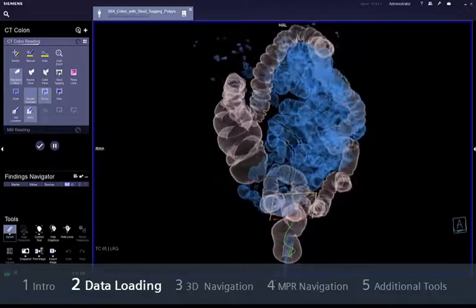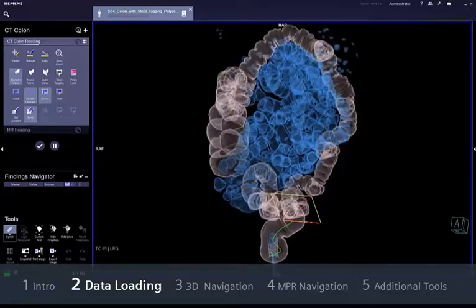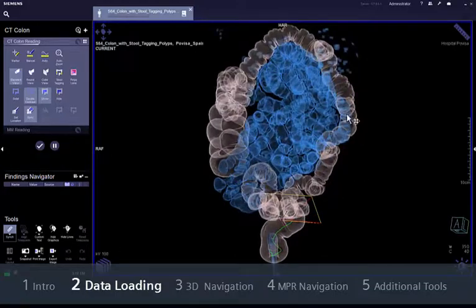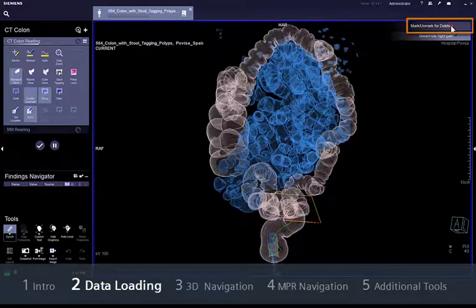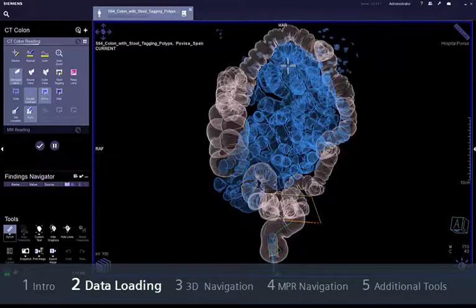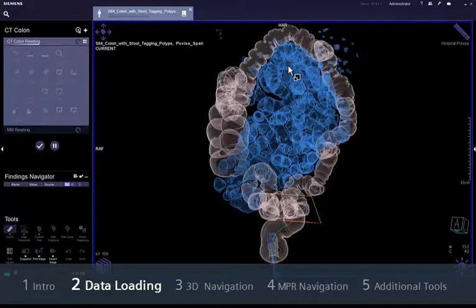If correction is needed, select Mark/Unmark for Deletion from the upper right corner menu and click on the area you want to correct. Notice how the colour will change accordingly.